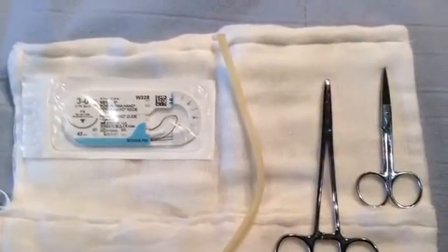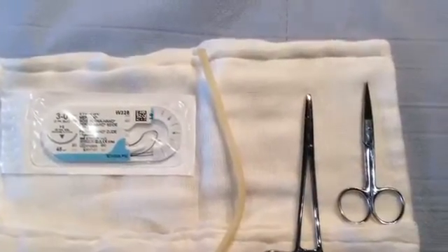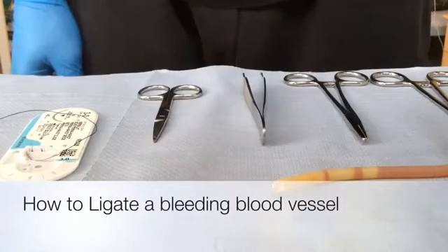You will also need some suture material and a haemostat. In this video, I am going to teach you how to tie off or ligate a bleeding blood vessel.